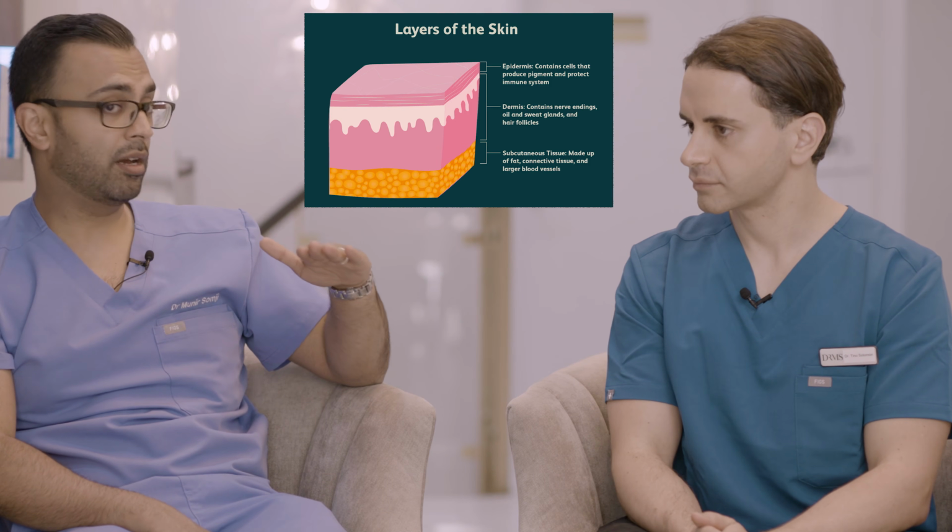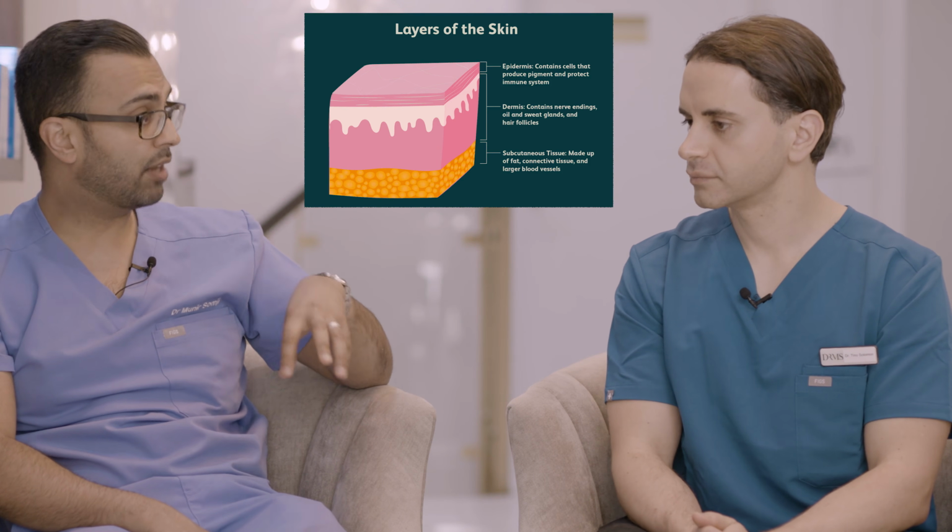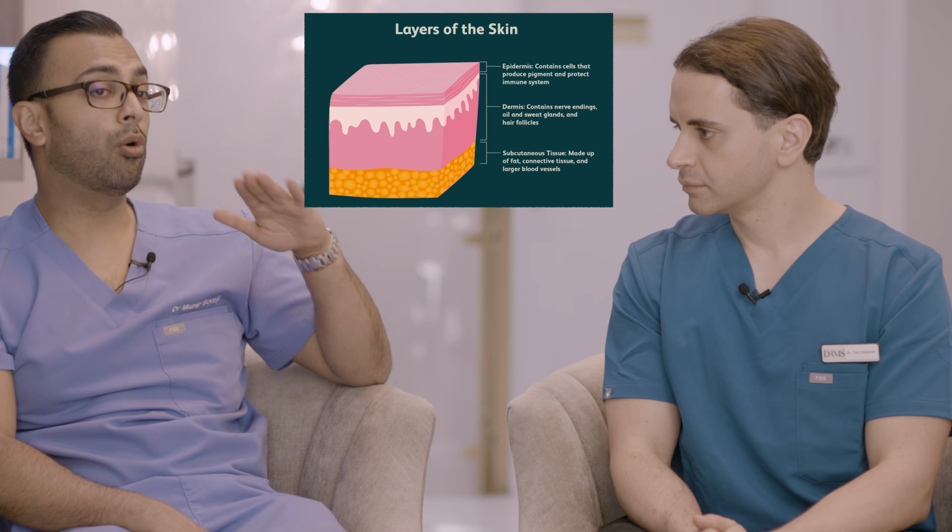When people are talking about ablative and non-ablative, it's really about how deep it goes. Does it remove the epidermis, the outer layer of the skin, and get down to the dermis to promote collagen? Or is it just very light on the top, which we normally call non-ablative lasers? So you can get different types of lasers, and different depths based on the energy used. Absolutely.